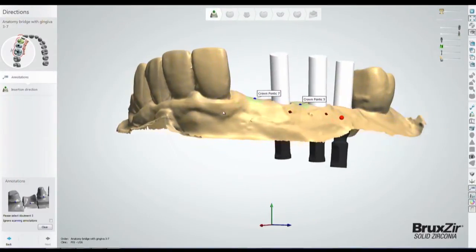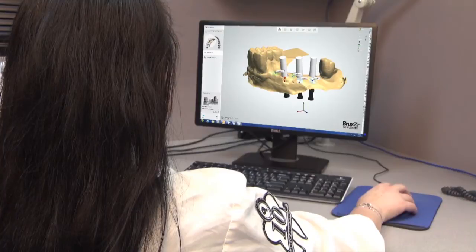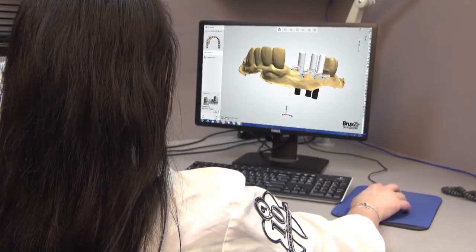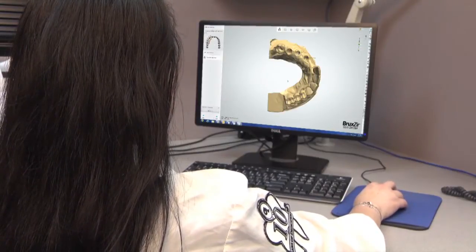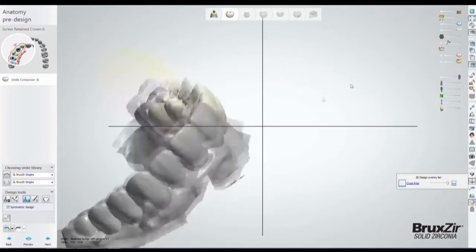Dental CAD software automatically merges the spatial data collected in these scans to produce a highly accurate digital model of the final prosthesis, accounting for the positioning and orientation of the implants.